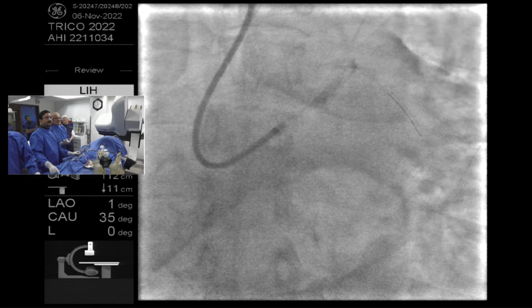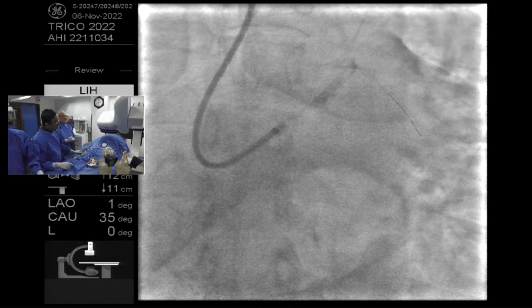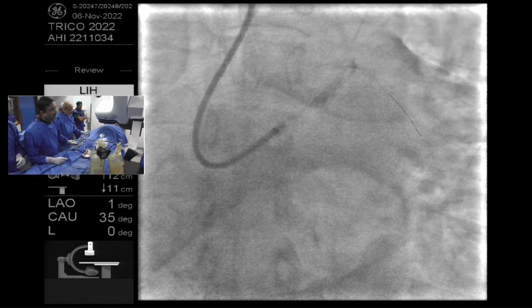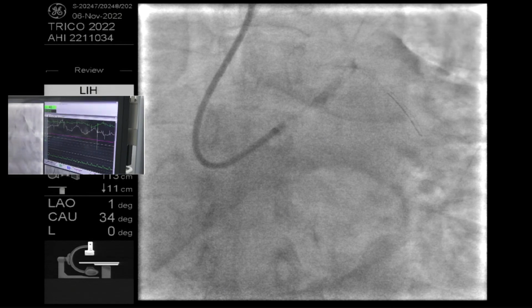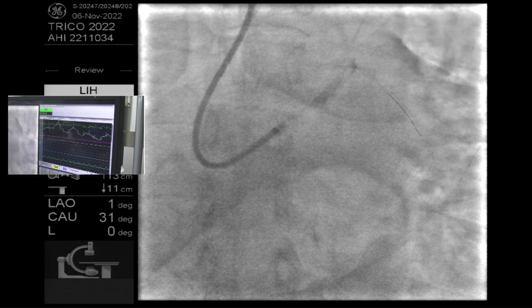See, there is a little bit of hypotension, but the ECG is pretty normal. Give fluid. Yeah, it's probably just vasodilatation. You give any medication for the blood pressure? Adrenaline given intravenous.